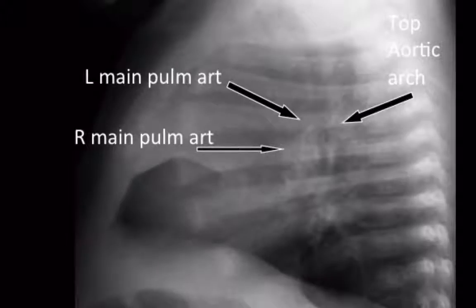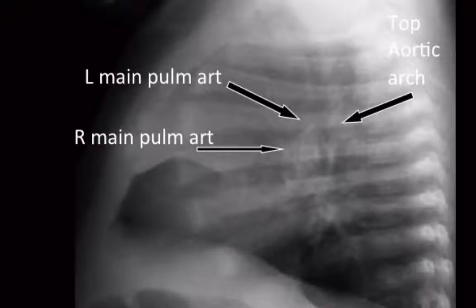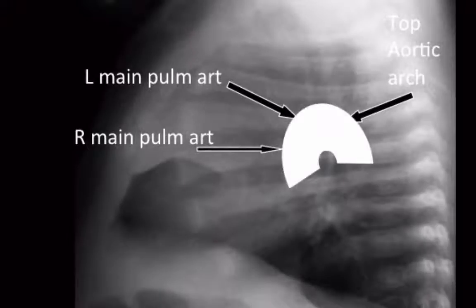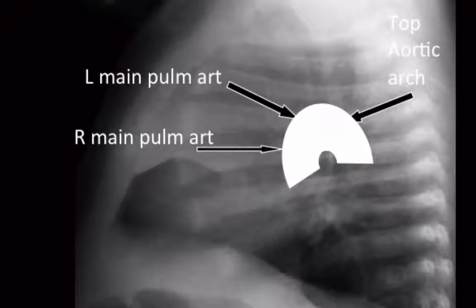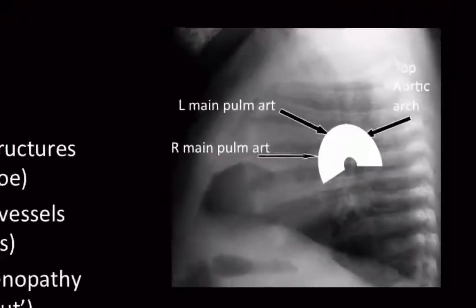I'll show you this in imaging form, but first — lymphadenopathy is called a donut sign on a lateral chest radiograph. I didn't invent the sign; it has been described by Caffey and other old-time radiologists, and we persist in using it. That's the upside-down horseshoe. This means you shouldn't call any lymphadenopathy in this region because even if there is lymphadenopathy, we cannot be sure — it looks no different from the normal vessels.